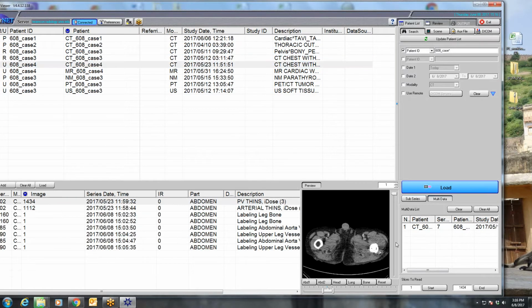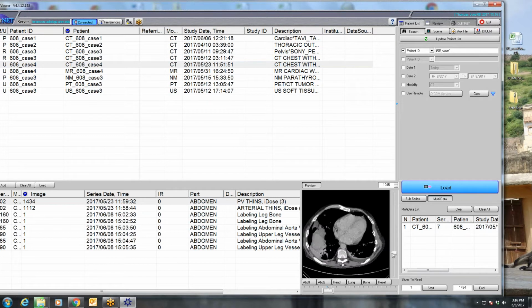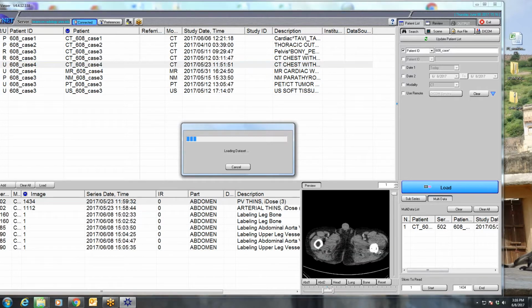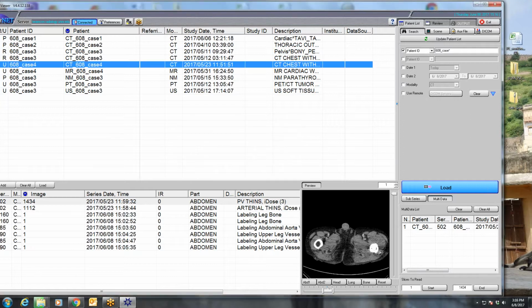Okay, I showed that one. And then last, this one, I can't remember what this case is. Oh, yes, it's an interesting case. This guy came into the emergency room with fever and so on, and got an echocardiogram.